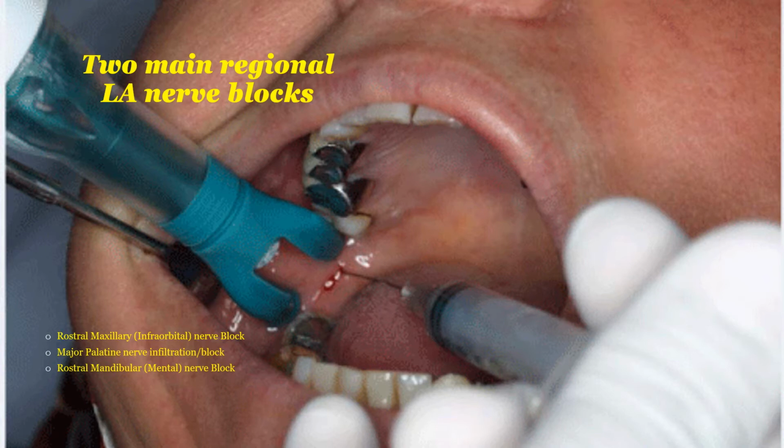Just remember that with any injections that you give, we use as small a gauge needle as possible, 25 gauge or smaller, preferably 27, 29 or 30 gauge needles. We do need to aspirate, so we need to draw back before we inject. We've got to make certain we're not in a blood vessel before we inject.